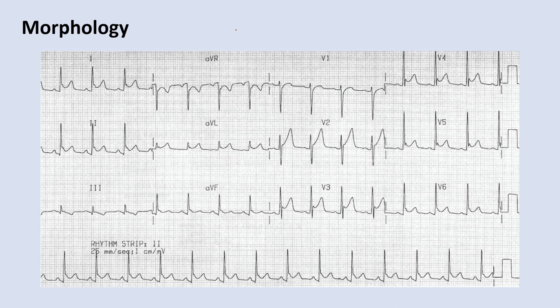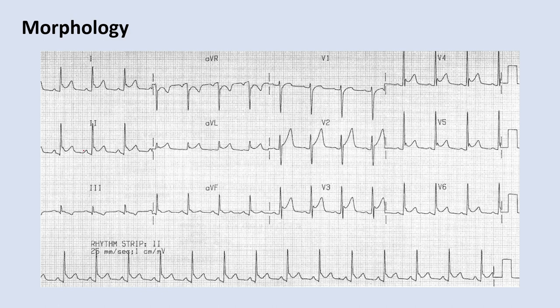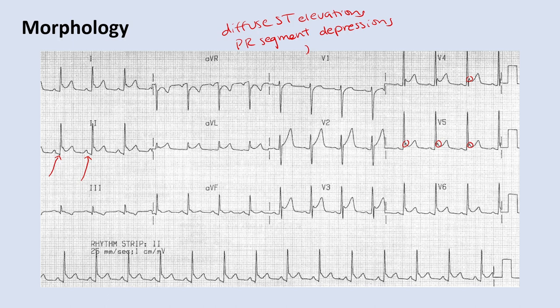This EKG shows diffuse ST elevations in almost all leads, depressed PR segments, and J-point elevations — findings of acute pericarditis. The diffuse ST elevations are the classic buzzword, but in practice you may not always see them. You may instead see PR segment depressions or J-point elevations in the right clinical context, which should clue you into acute pericarditis. So look for: diffuse ST elevations, PR segment depressions, and J-point elevations.